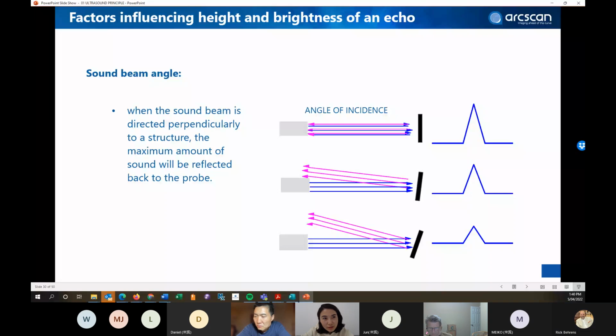Helix. It's 35. Helix, not only 30, 35. It covers different frequency from 20 to 60. Yes. But what I'm saying is I'm comparing only the 50 megahertz. Quantel 50 megahertz, when you do the test, it will read between 30 and 35. And yet it is considered 50 because of the penetration and the resolution that it provides.